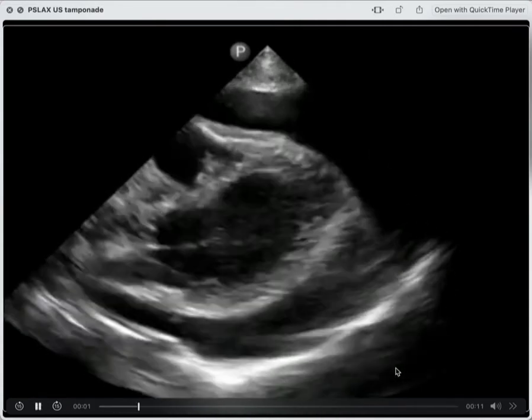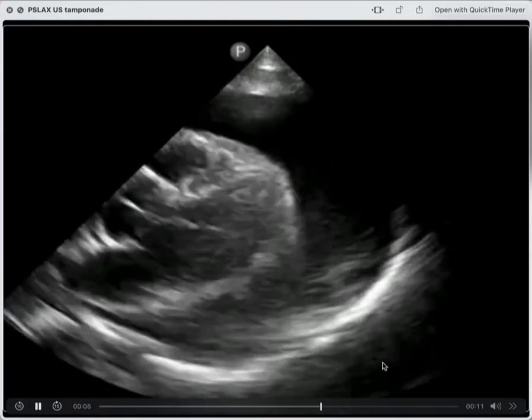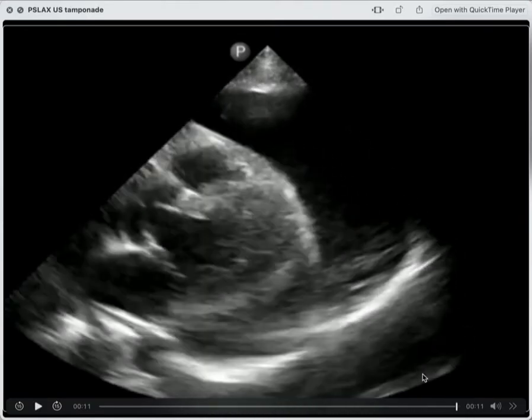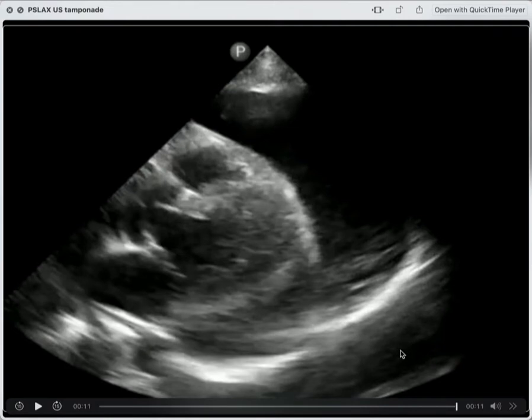You can see down here, is this a pleural effusion? It looks like an anechoic area. But then you can also see right here, this is beating. Why would it be beating? So is that a mirror image and it's just artifact? Or is it really a pleural effusion along with it? And of course, to rule that out, it's a simple thing to do. Just pop the ultrasound probe in the position as if you were doing a FAST exam and go superior a little bit on the side of the patient, and you can find the diaphragm and then see if it's actually a pleural effusion or not.